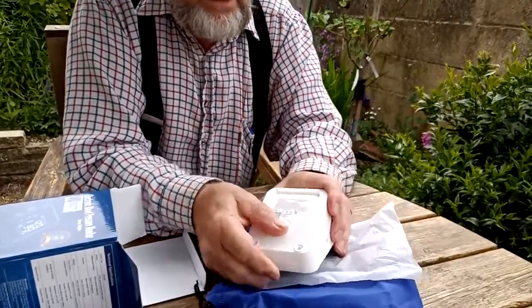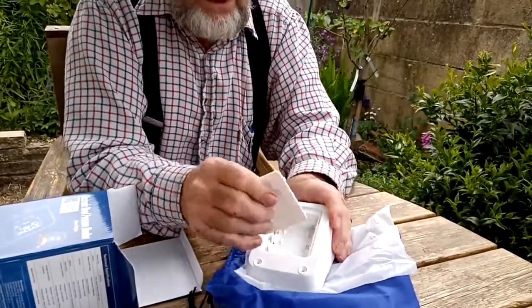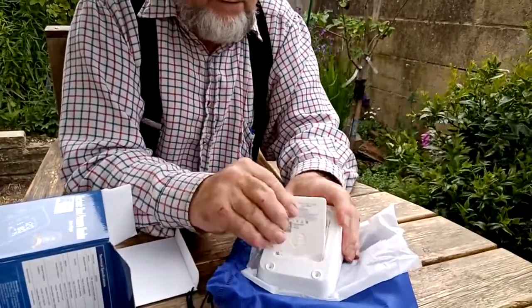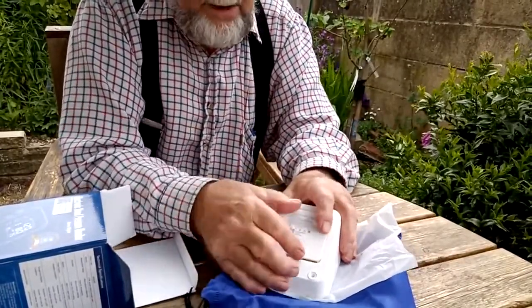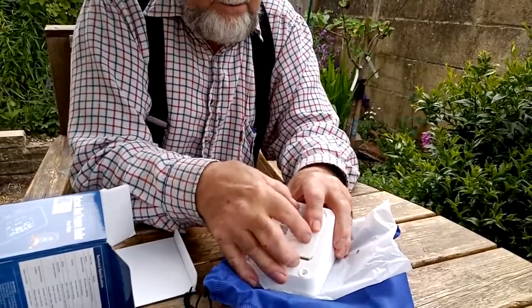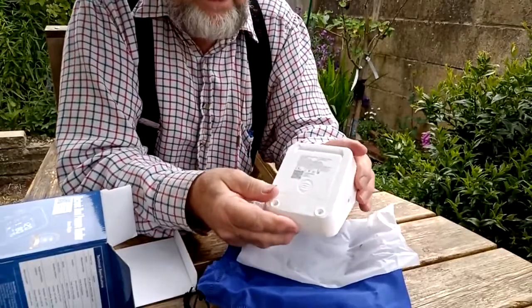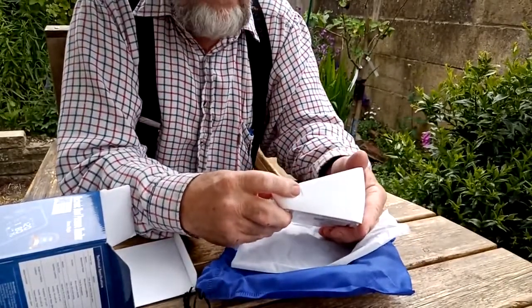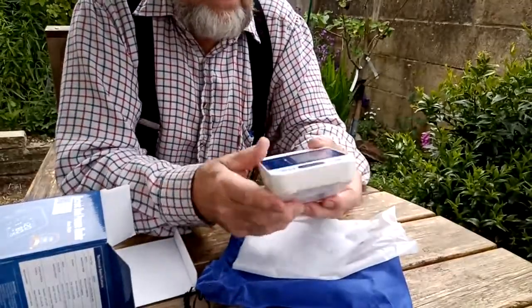Here is the battery compartment cover, so you just slide it up and you've got 4 AA batteries in there. I'm going to set this one up with rechargeable batteries and see how we get on with them. And you just put it on at the top here, make sure everything's slid into the correct places, and then slide it down and it positively clicks. And there is the input for the USB power supply.